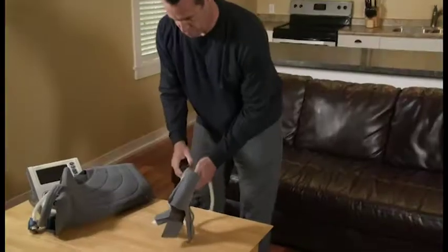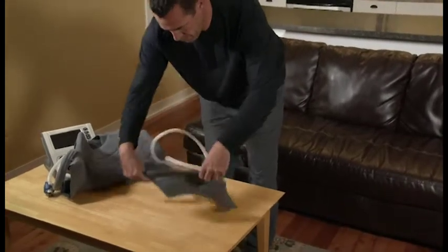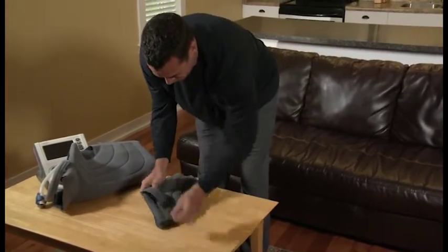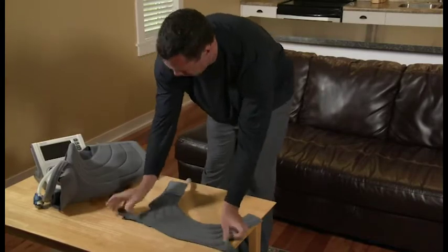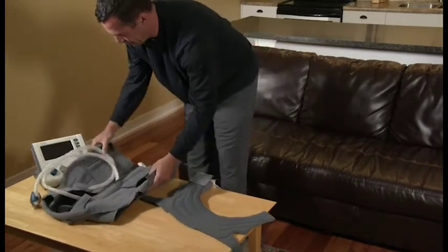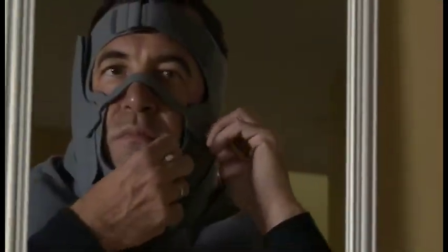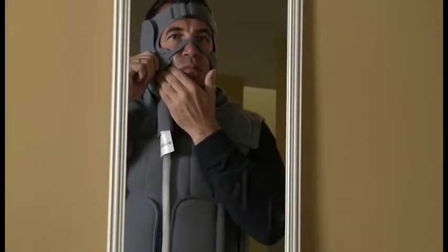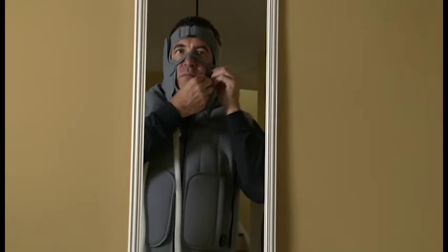For initial application, locate your head and vest garments and place them where you will conduct your therapy session. Unfold your head garment so the head strap is facing up and located at the top. Unfold your vest garment so the zipper is facing up. The head garment should be applied first, followed by the vest garment. When applying the garments, a mirror may be helpful for garment placement and fitting.